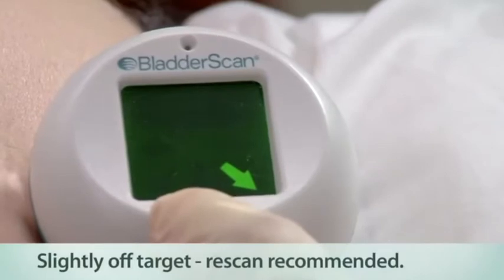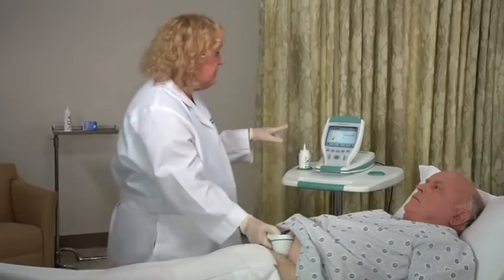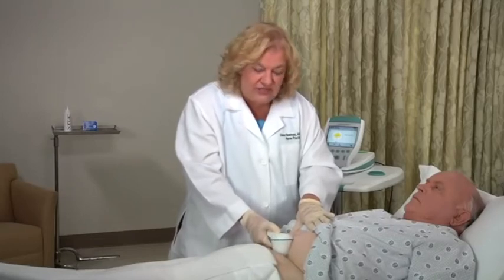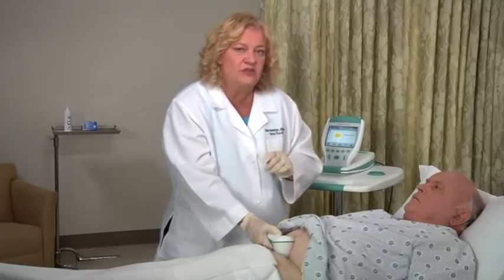A solid arrow means you are slightly off target. A flashing arrow means you are significantly off target. The console will confirm that the bladder is off target from the crosshairs and an arrow will point in the direction of the bladder. Note that the 12 o'clock position on the console target coincides with the orientation of the patient's head. You may also see a screen that indicates the pubic bone is inside the ultrasound cone. If this occurs, you may want to re-aim and re-scan, as there is a possibility that the pubic bone is obscuring some of the bladder. By re-aiming, you can ensure that you have captured the bladder fully inside the ultrasound cone.